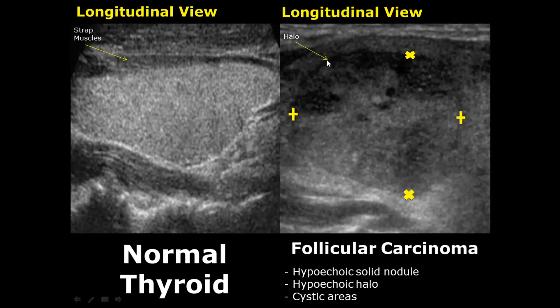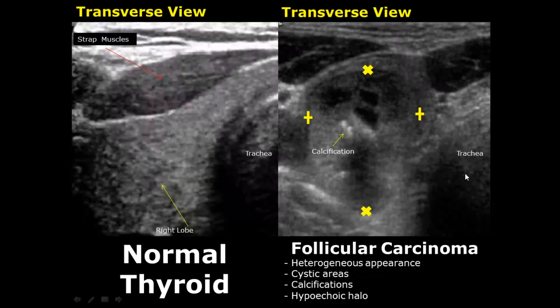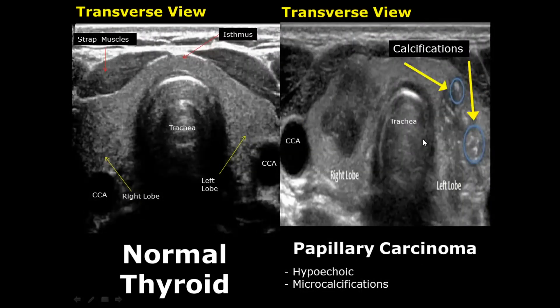Follicular carcinoma will have a hypoechoic halo, a hypoechoic nodule, and can have some cystic areas. These appearances overlap with other conditions, so we cannot confirm it on ultrasound alone. Here is a transverse view of follicular carcinoma also containing calcifications. You can see a thin hypoechoic halo and cystic areas.